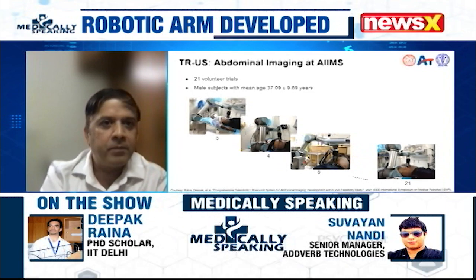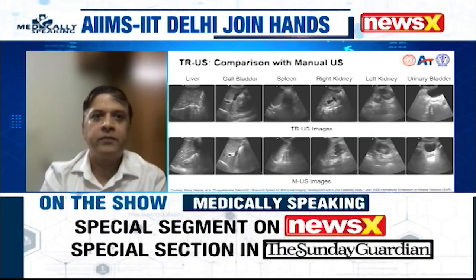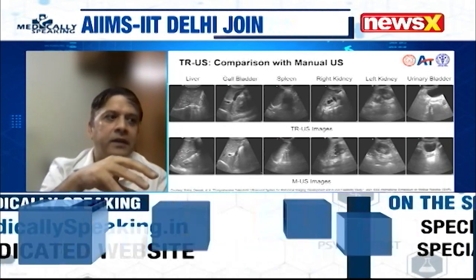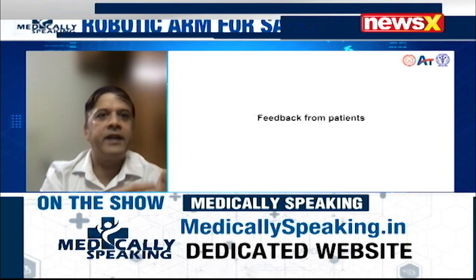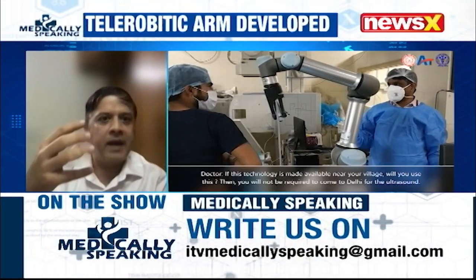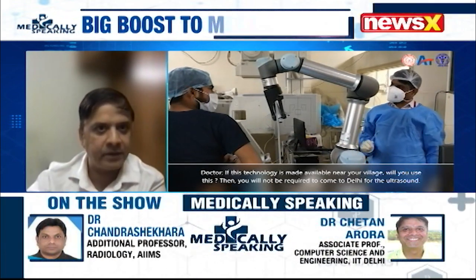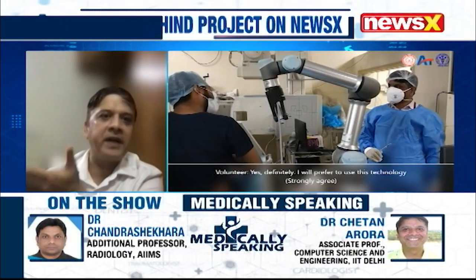If you put a pressure which is, let's say, beyond the patient's capability, then the patient will be hurt also. So that is what we try to do. The robotic arm has haptic feedback built into it. Whatever pressure the patient's body puts back on the arm is transferred to the doctor, who is holding the haptic device. So the doctor feels the same pressure in his hand.